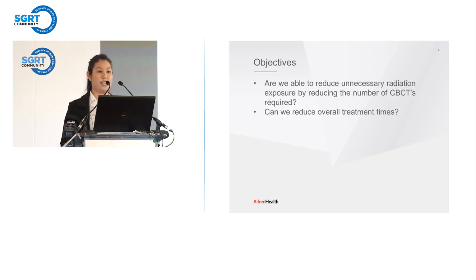So why did we decide to undertake this study? After treating multiple chest SABR patients, the staff started to question, why do we need to keep taking these cone beam CTs when we can tell from the SGRT monitoring that the patients hadn't moved, and that the corrections that we were having to do after the repeat cone beam CTs were minimal. We were also noticing that most of the patients' appointment times were spent taking and assessing the cone beam CTs, and started to wonder if these repeat cone beam CTs could be eliminated.